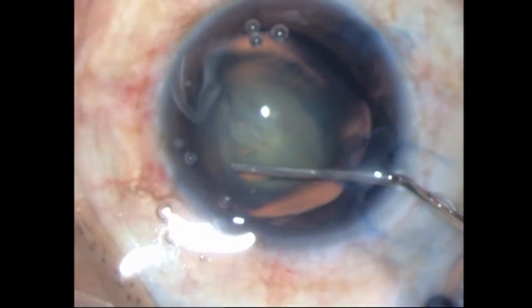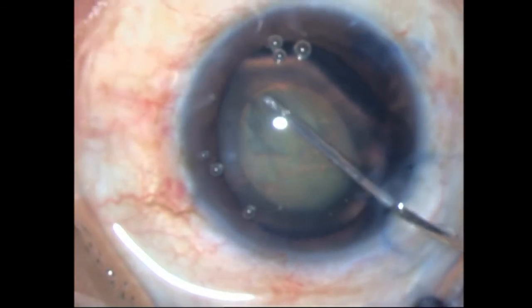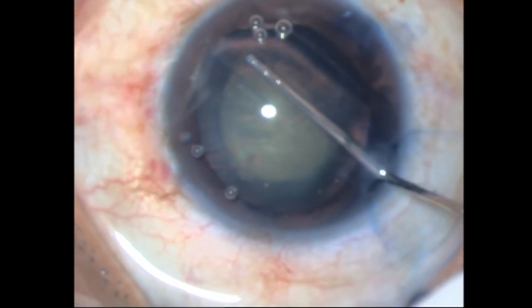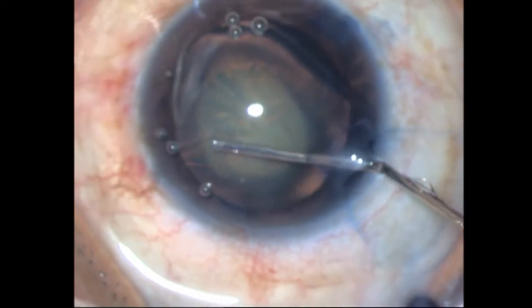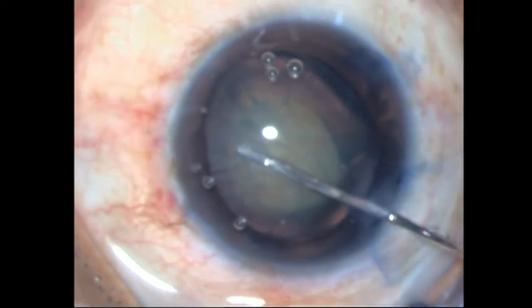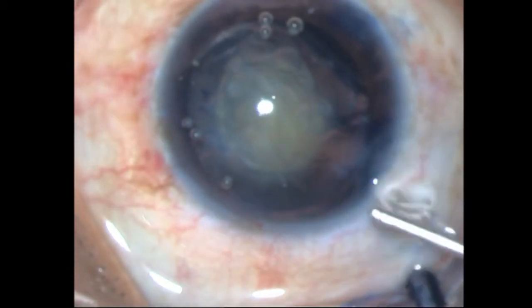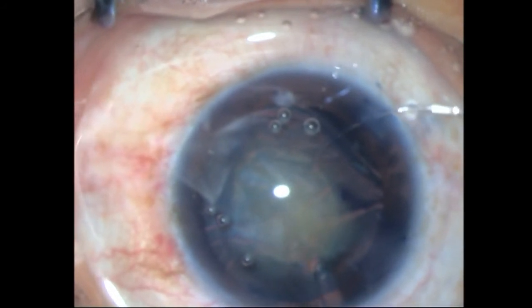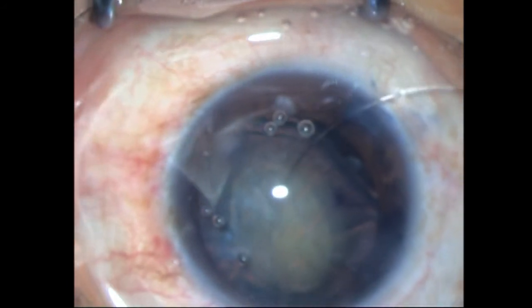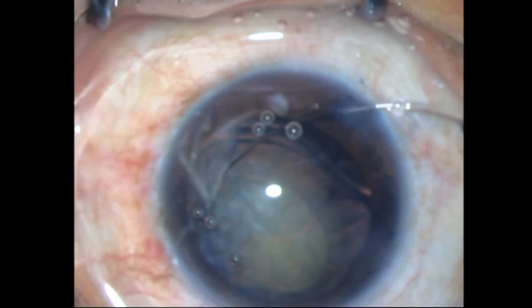I know my hydrodissection is perfect, however I just put in a few more fluid waves to try and separate as much cortex as possible before the next step — placement of the capsular tension ring. I'm inserting the CTR through one of the side port incisions. In my enthusiasm I have forgotten the step of supporting the ring, but I'm just guiding it, watching it go across that colobomatous area.